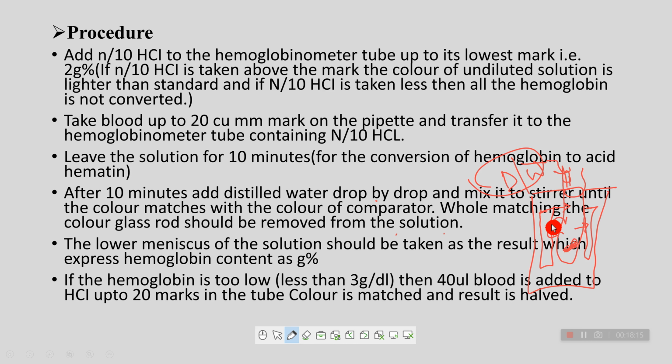When the color of the solution matches with the brown glass comparator, we will stop adding the distilled water.